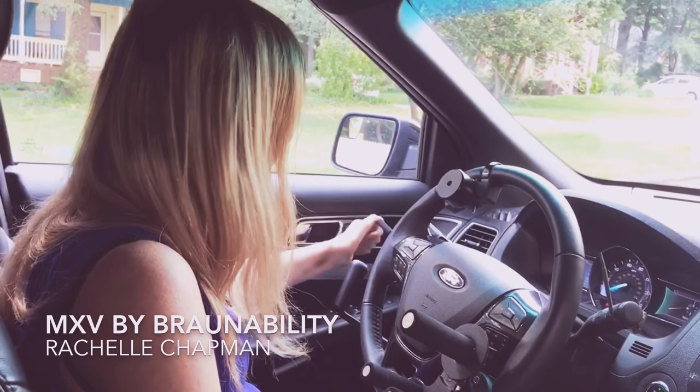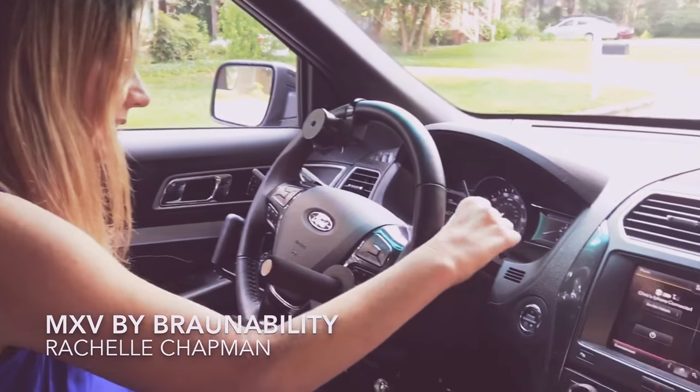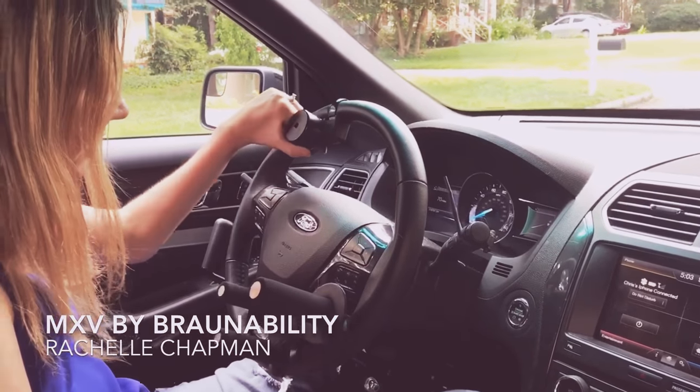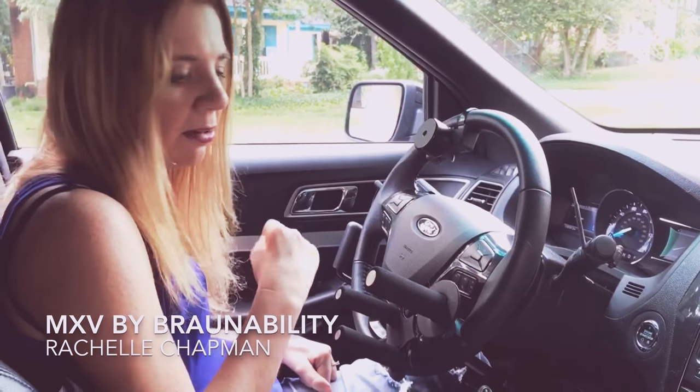I've got turn signals that have extensions. This is the windshield wipers, and that has an extension too, so it's easy for me without my finger function. And this right here is a weight that helps me turn the wheel, since I don't have full strength in my arms.